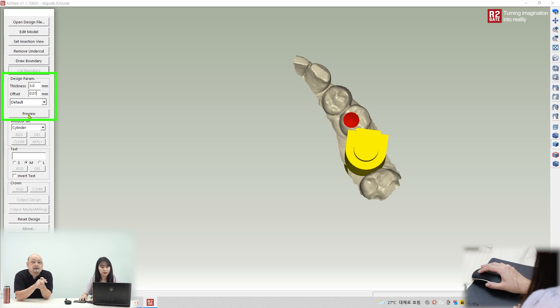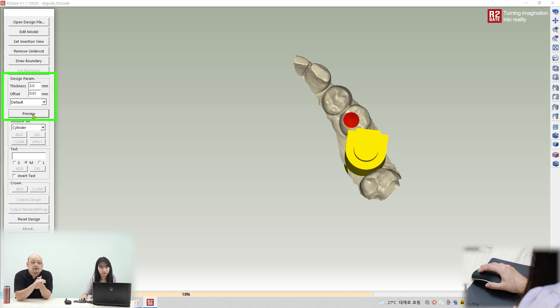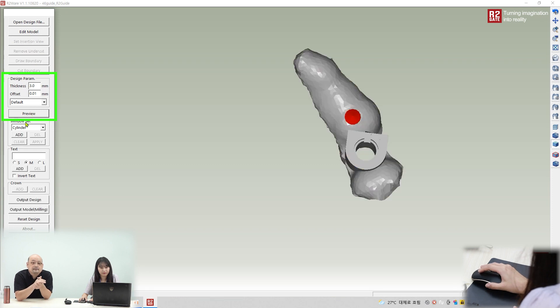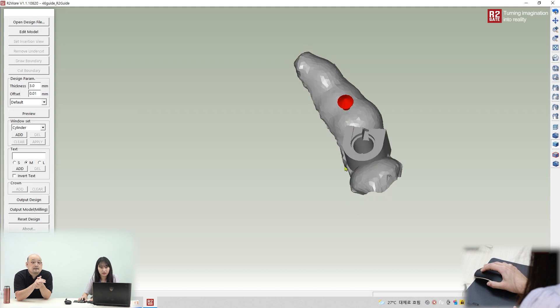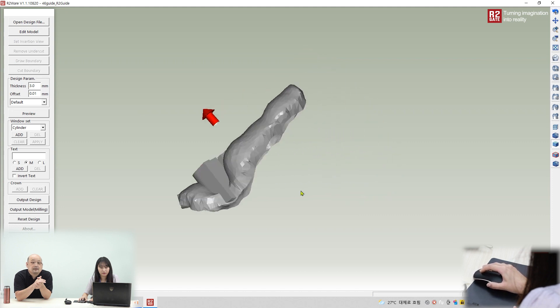Then click the preview button to see the guide design. Yes — this is the guide design preview.